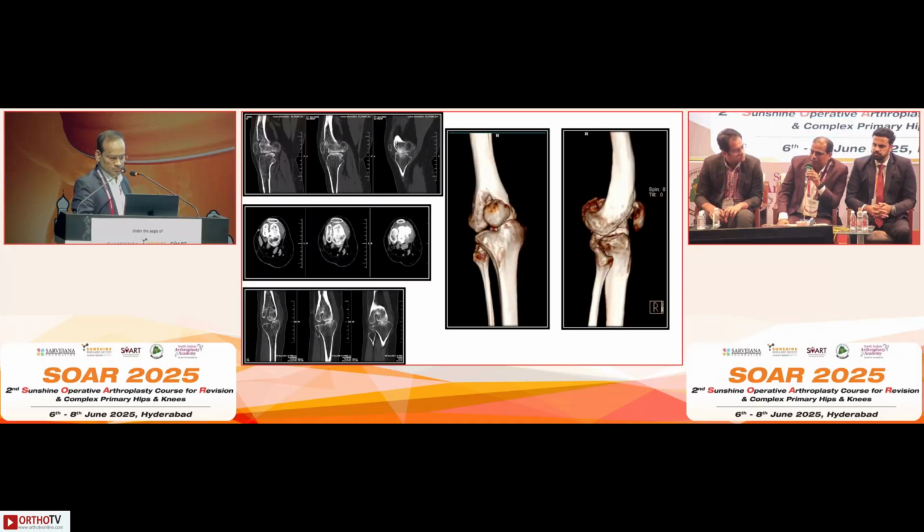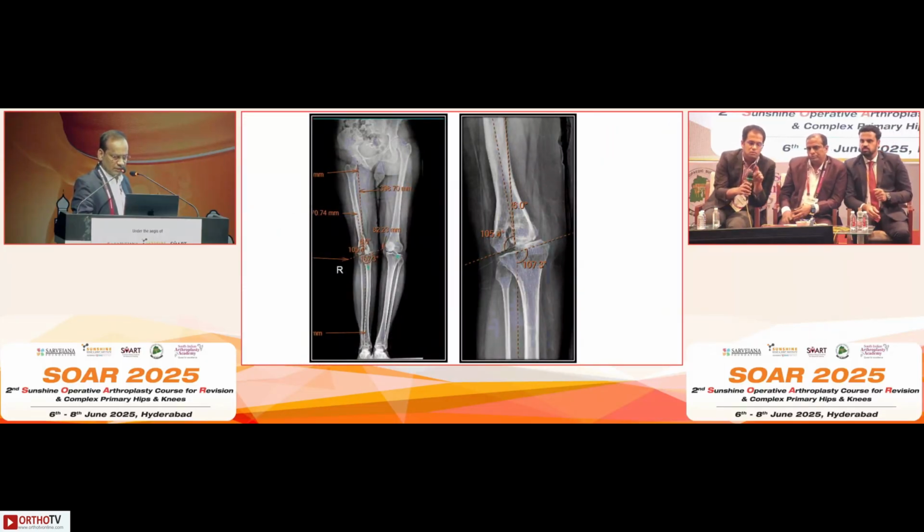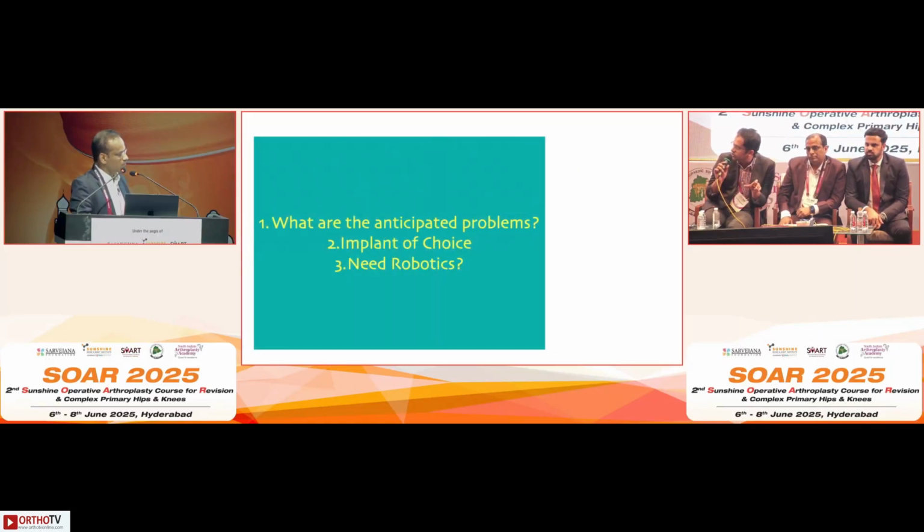That can be accommodated, but of course with the CT scan already done, you calculate the medial-lateral diameter and anteroposterior diameter, and check that the minimum diameter should be around 57 mm in the femur. If it is not there, then it is difficult. So this is all X-ray. Regarding the size of constrained implants, there is one not commonly used in India: even if you have a femur size of 53 or 51 mm, you can use an Implantcast. It's from Germany. They are mostly into tumor implants, but they have these special small sizes.